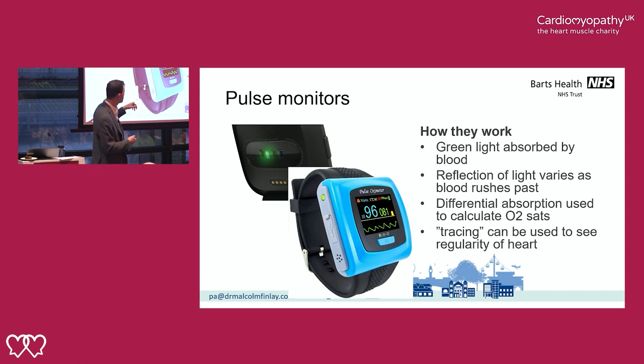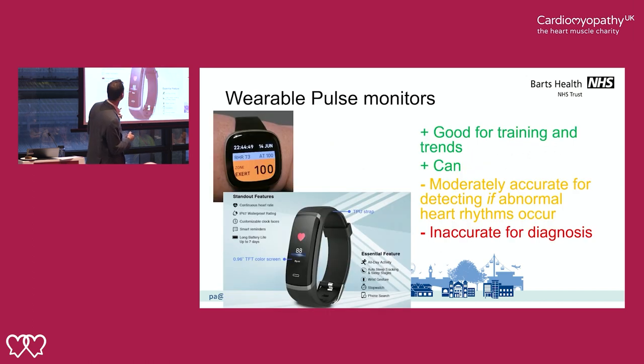And the last thing just to mention, and I might have a slide on it: every so often you have ones that say they can measure blood pressure. And there are a few which claim a blood pressure accuracy, and they tend to be so-so for that. They tend to be okay for trends, but I think there's only one which has got any claimed real accuracy. When you look at them in detail, they're always sort of like, this should be used for interest only. And it's a bit hard, I find, if I didn't know deeply about things, because some of the devices which say this is only for trends, not a medical device, are just as good as our medical devices, whereas other ones are not so good.